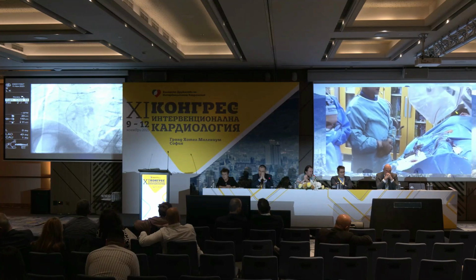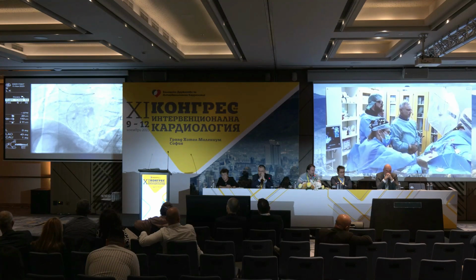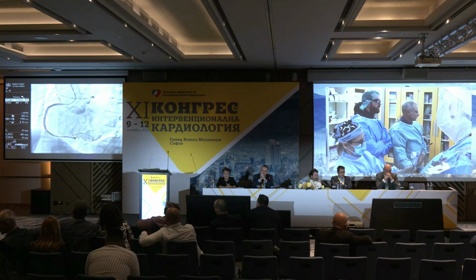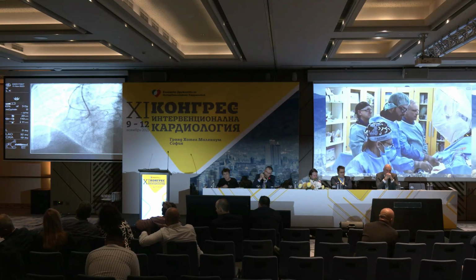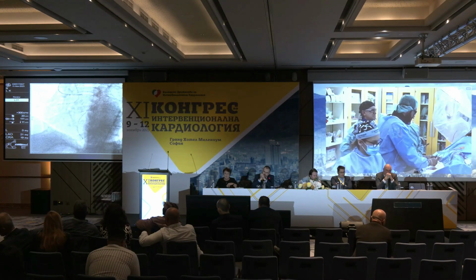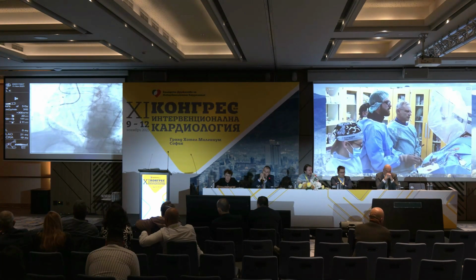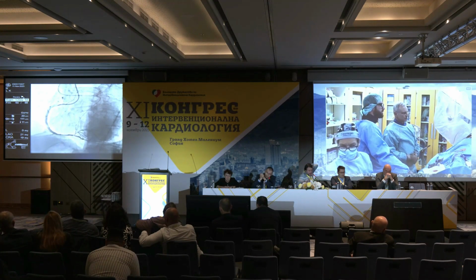There is a small leak in the junction between the two stents. We didn't go with a 4.5 balloon there. Can you see it? Yeah, we see it. I didn't see it. So it's exactly at the point of the overlap. Let's make a small injection there. Maybe not, maybe yes. No. Maybe from a different position we can check. Yes.